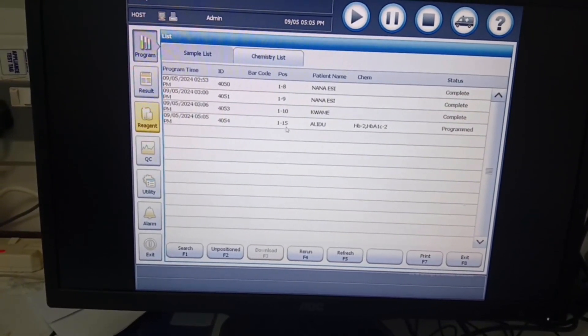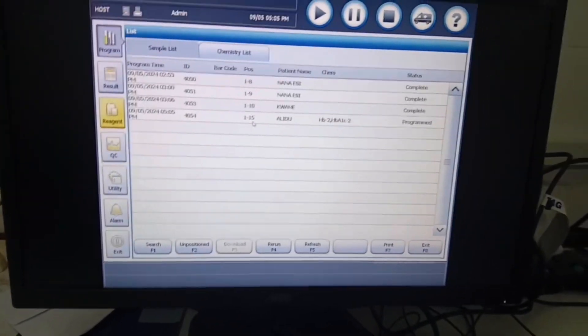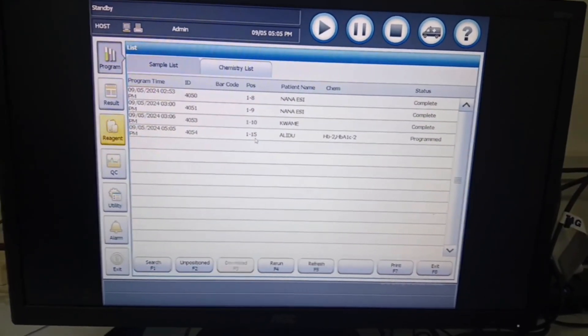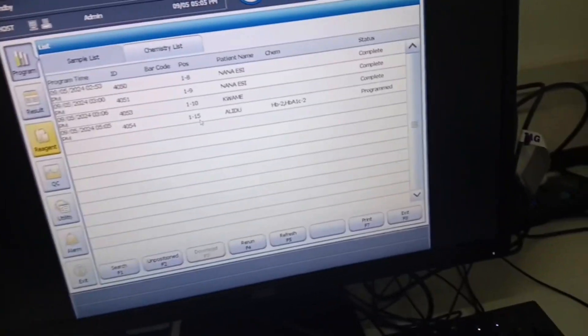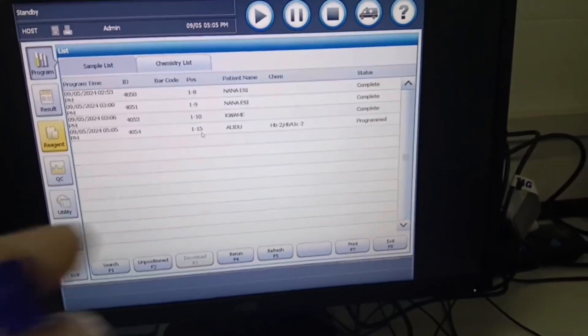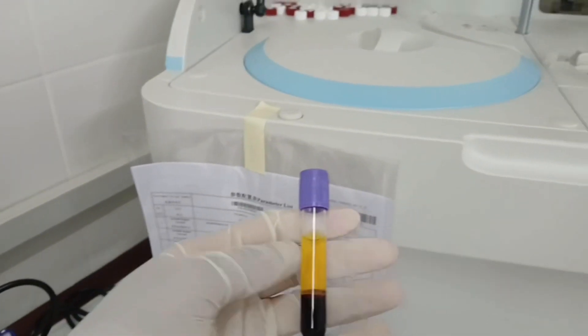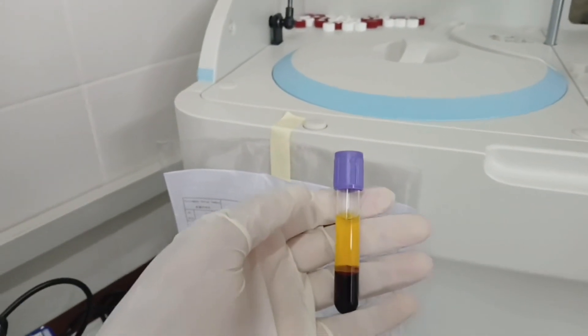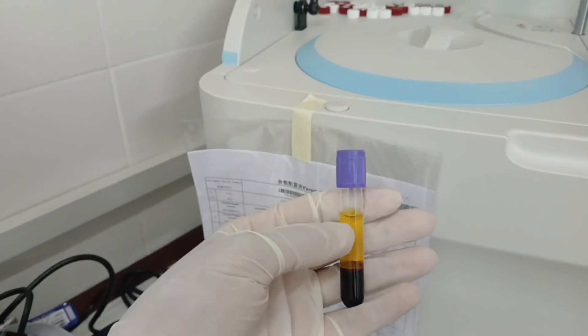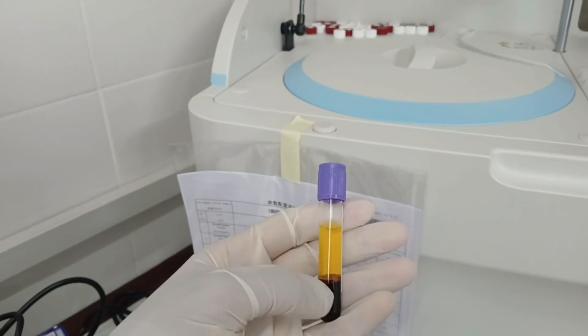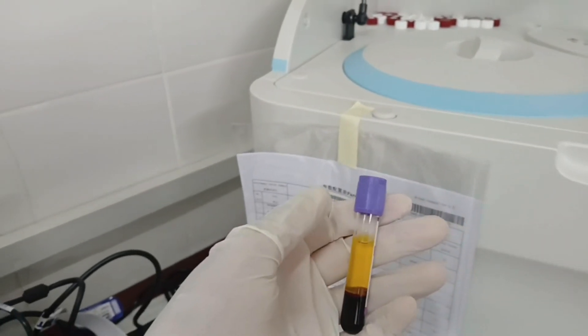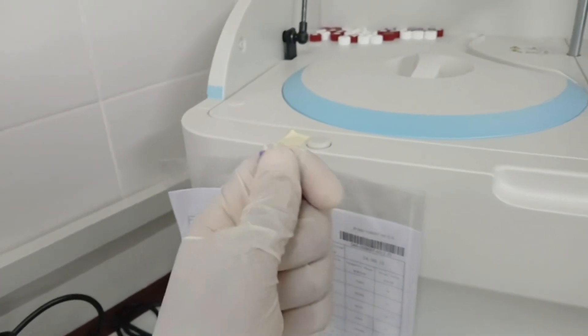Our centrifuged sample is ready and this is how it looks like after centrifugation. We have the plasma and the packed cells, the RBCs.